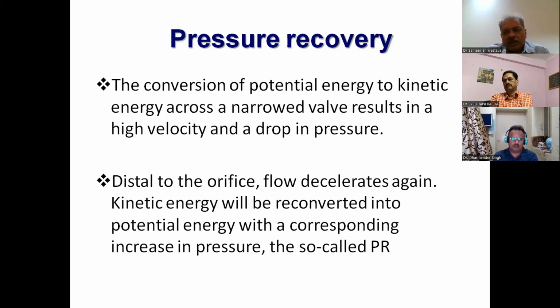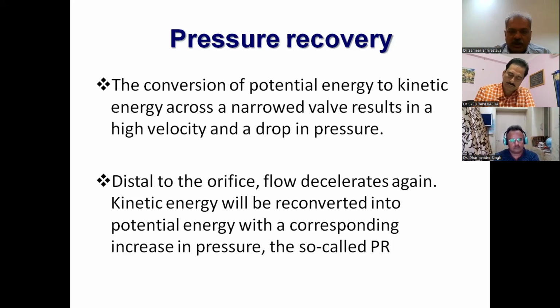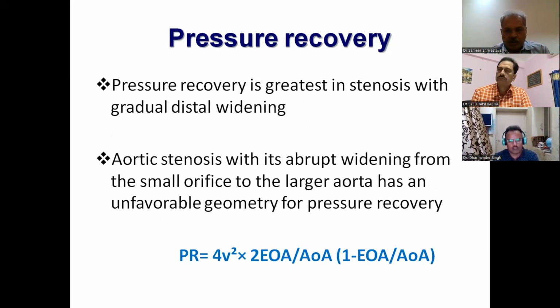This was very interesting, and it is more often now seen in prosthetic valves, but you can see it in native valves. It was actually described in native valves first, that the narrowest portion is where the highest velocity is. And when you put the pressure across this segment of highest velocity, you might record very low pressures. But the moment you go distally, you'll find that the pressure recovers. This is known as the pressure recovery phenomenon. With the advent of continuous wave, it is seen more seldom than what is described. But since we are discussing theory also, it's appropriate to discuss this.